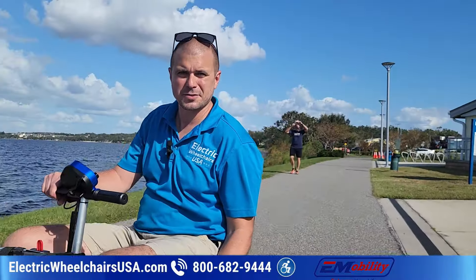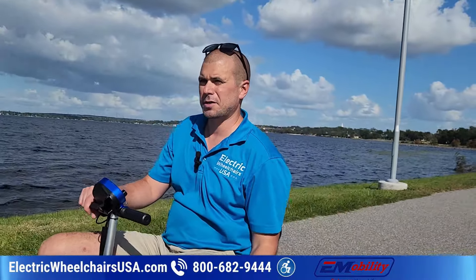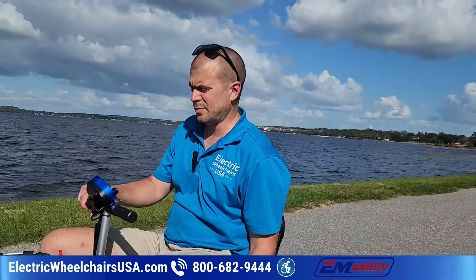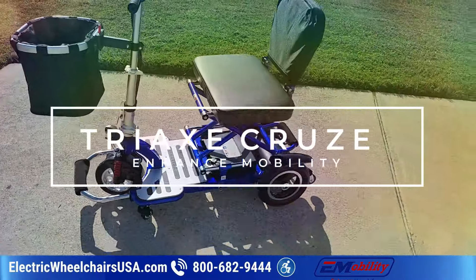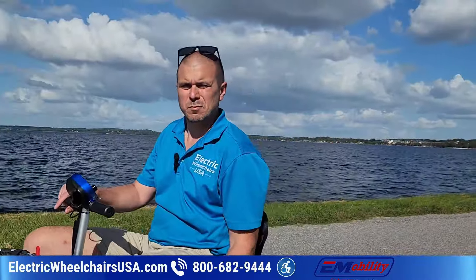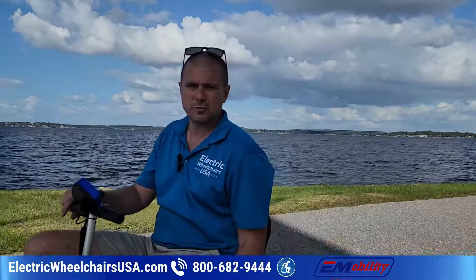Hey guys, this is Kellen from electricwheelchairsusa.com. In this video we want to show you more about the popular scooter made by Enhance Mobility — it's called the Triaxe Cruze. It has a sister scooter called the Triaxe Sport; they're very similar but there are a couple of key differences between the two that I'll go over.